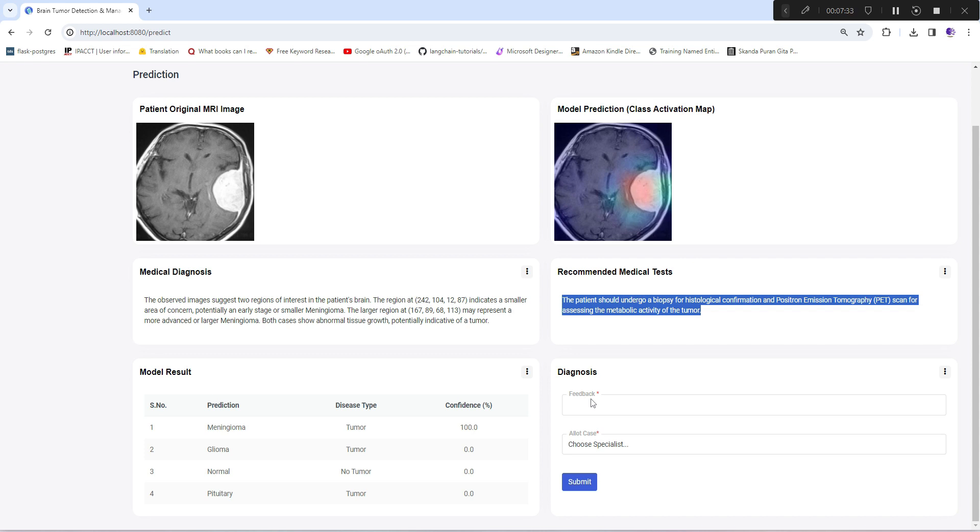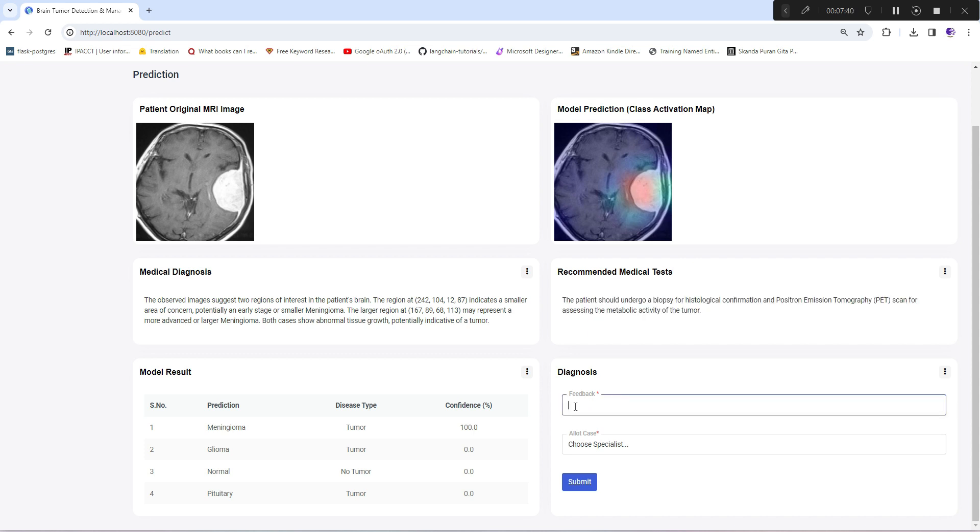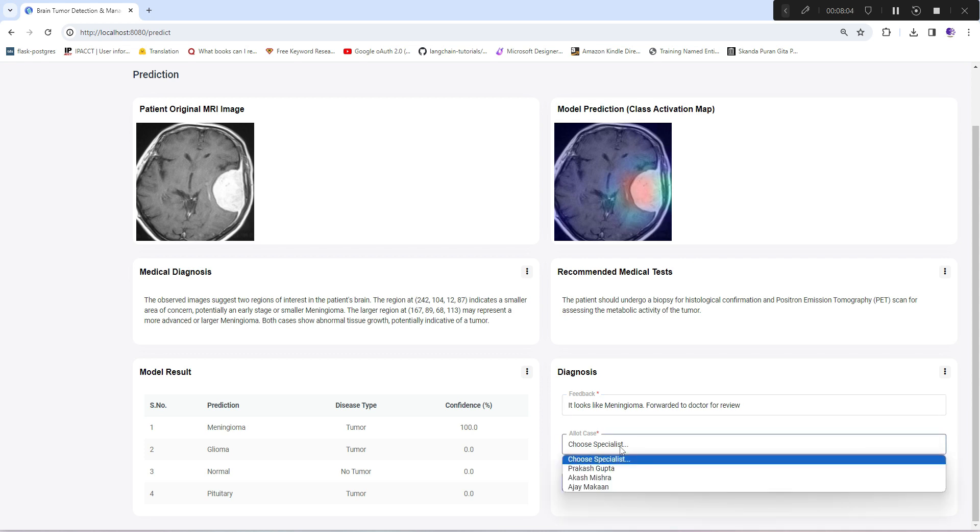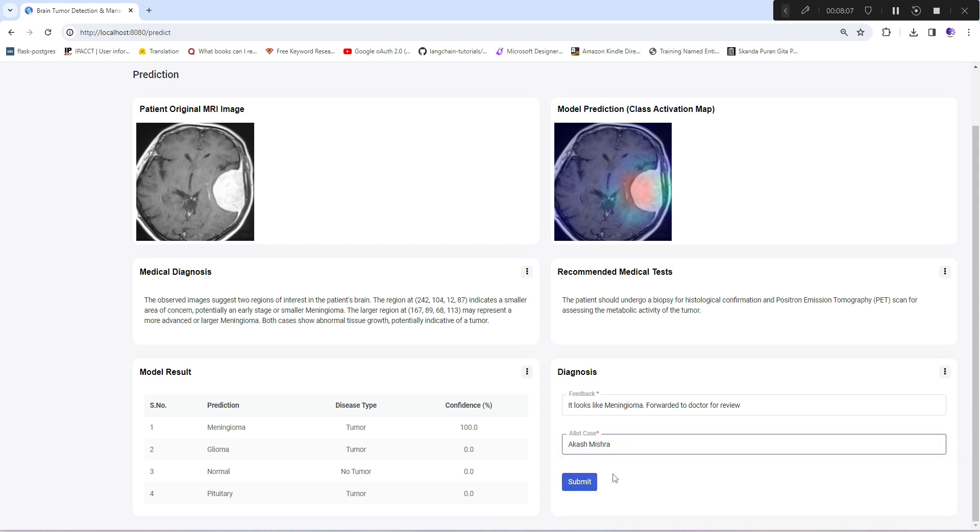Below is the model result showing how confident the model is in predicting a particular disease type, which helps the nurse or doctor understand the prediction confidence. For diagnosis, I'm giving feedback from the nurse side: "It looks like meningioma, forwarded for review."